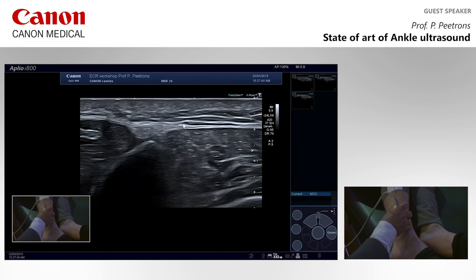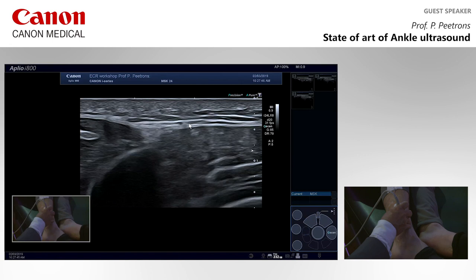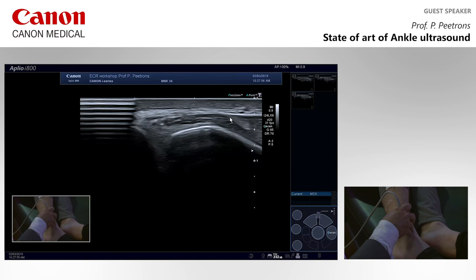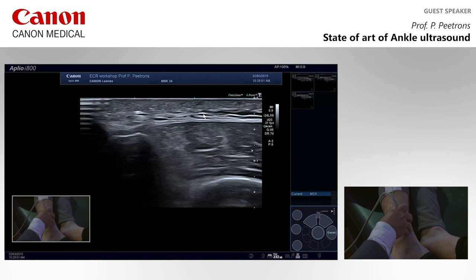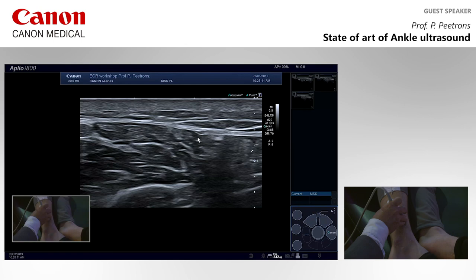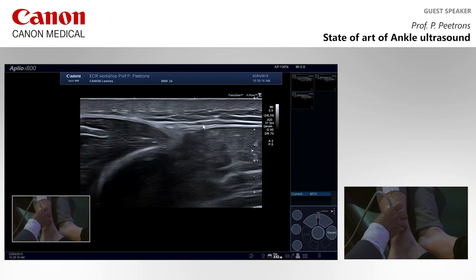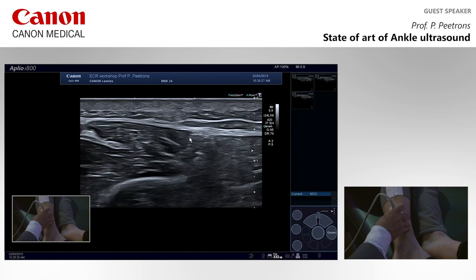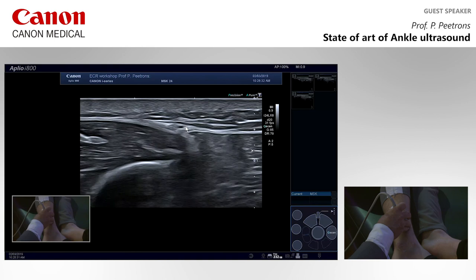And you see that at that level, exactly that level, 10 centimeters above the malleolus, this superficial peroneal nerve is becoming subcutaneous. And you can follow it everywhere. But exactly here, it is coming from the subcutaneous part of the leg to the infrafascial part of the leg, and then to the muscular part of the leg. Okay, and this is exactly where you will find the neuroma of the superficial peroneal nerve. Okay, of course, this is a 24 megahertz probe. I think you can see it with every equipment, but not as well sometimes. But this is exactly where it is crossing the fascia.